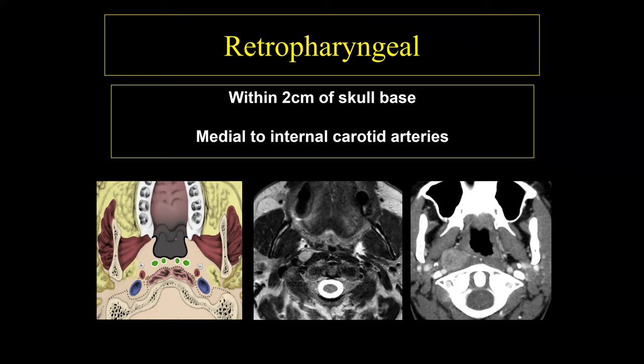The retropharyngeal lymph nodes consist of a lateral and a medial group. As patients get older, the lateral group is more likely to be involved by metastases. They are typically located just medial to the carotid artery and within two centimeters of the skull base. These lymph nodes cannot be palpated by referring physicians, so we must look for them in every single study we perform.